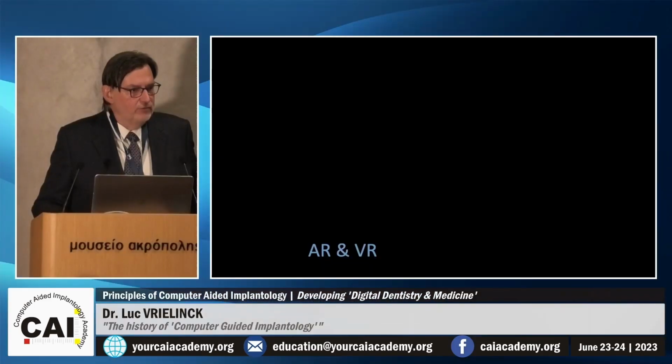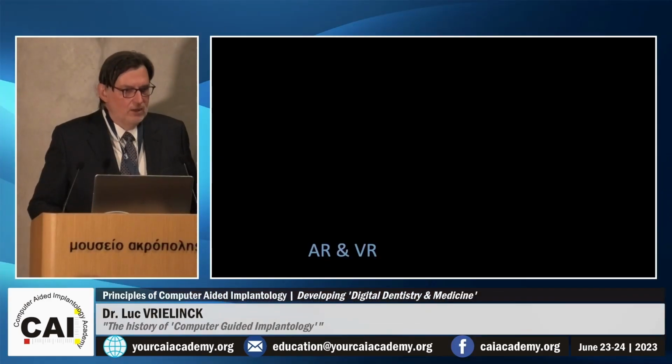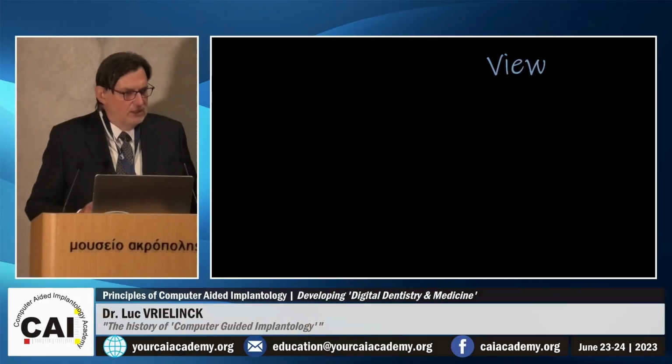Augmented reality and virtual reality, of course, will be developed for surgery, for prosthodontics, for the dental technician. They all will evolve in that direction. Then for the surgeon, he needs to have an actual on-the-spot view, meaning he is operating, and at the same time he is seeing the cone beam of the region where he is operating. He can evaluate pathology, he can evaluate densities or whatever. So this will improve, and this will surely come.